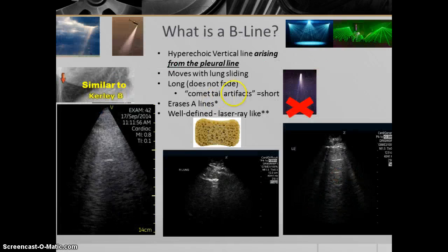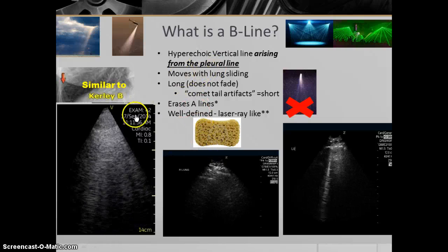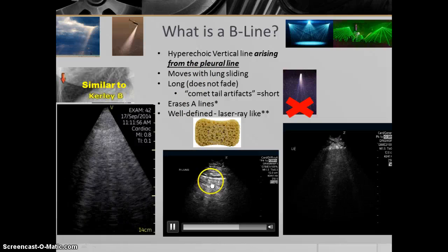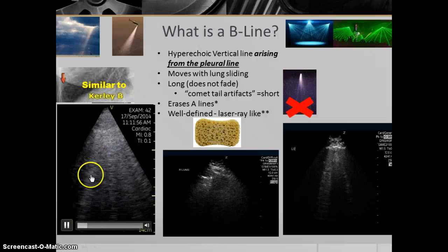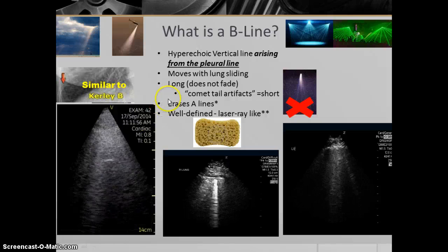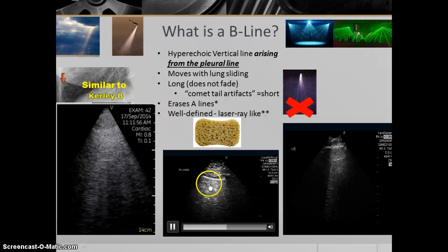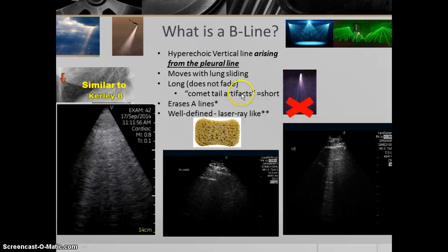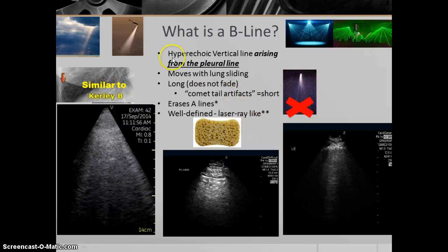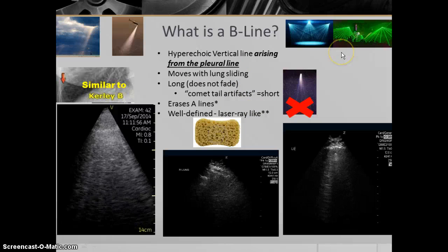When identifying a B-line, first identify the pleural line and lung sliding. The B-line should extend from the pleural line itself all the way down to the bottom of the screen, moving back and forth with respirations. Don't confuse B-lines with comet tail artifacts, which are much shorter and extend far less — those are normal variants. B-lines should appear like sunbeams, searchlights, or lasers.